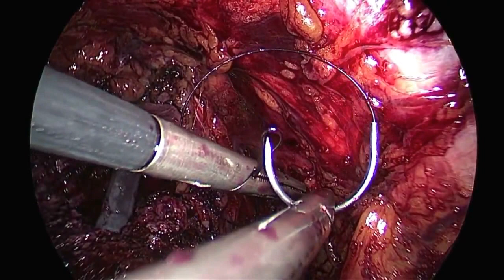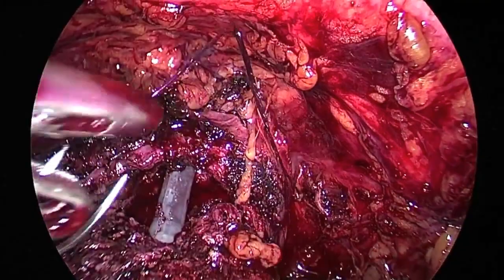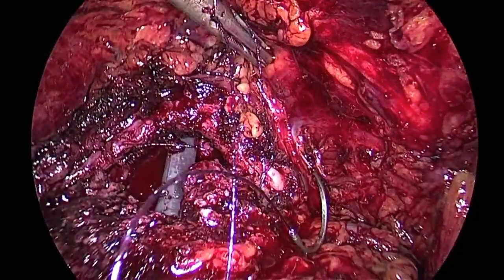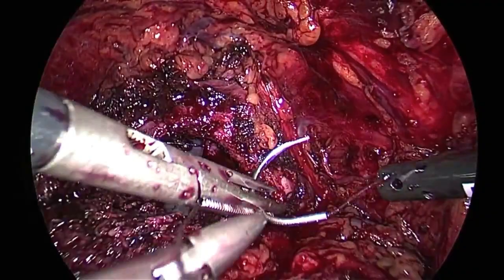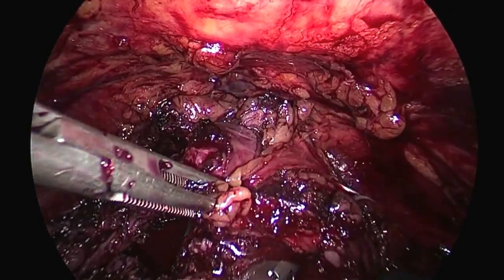Francesco? Yeah. And do you leave some drain? Yes, I leave one drain, a small drain, obviously. Aspirative? Not for bleeding, but only to check eventually for urine leak, because as you can see at the end, there is no bleeding at the level of the retropubic space, okay? We remove the drain after 2 days, not more. And the catheter after 3 days. Obviously, it's important to have a watertight suture.